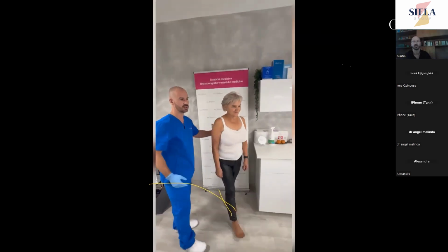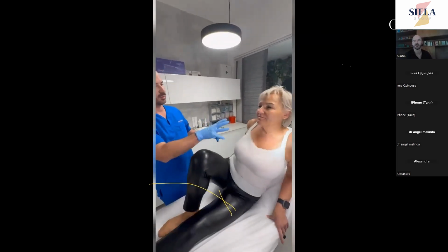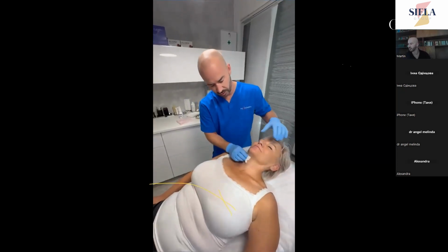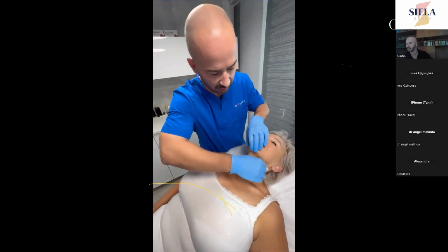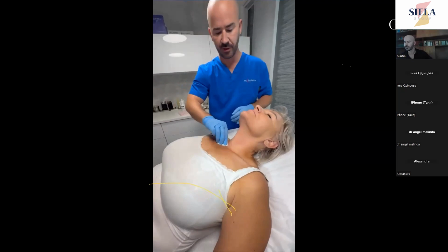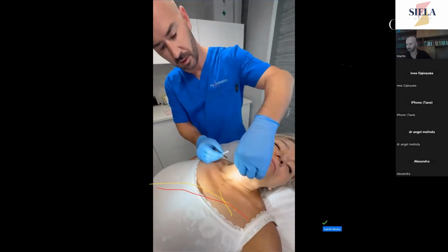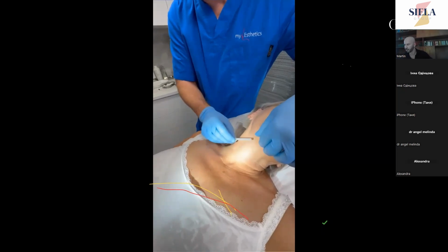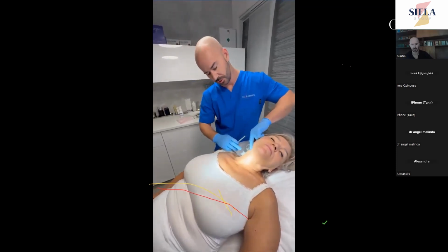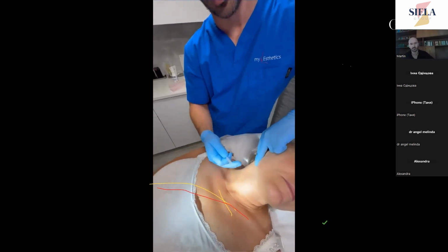So you can have a seat, just feel comfortable, and we're going to start with our field preparation with cleaning and anesthetics. We usually use Kutasept disinfection solution, and we clean the entire area. As we have chosen a longer, 70mm cannula, with an aim to cover a bit of the upper part of the whole area, we're going to choose the entry point a bit farther from the medial line, somewhere here.